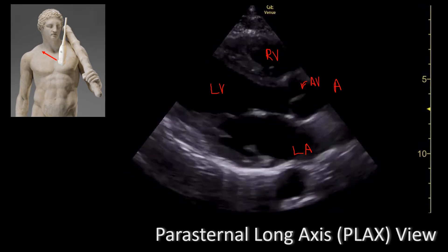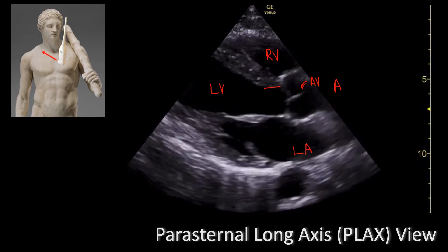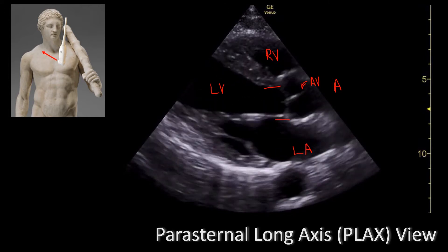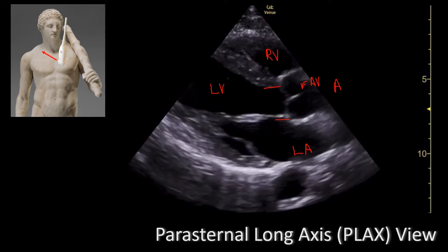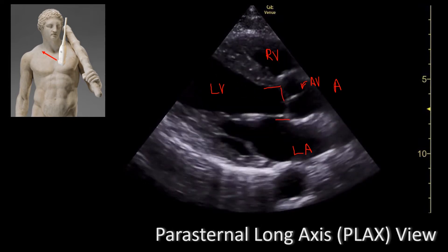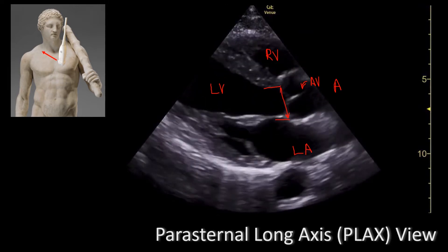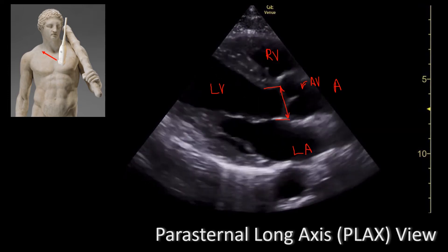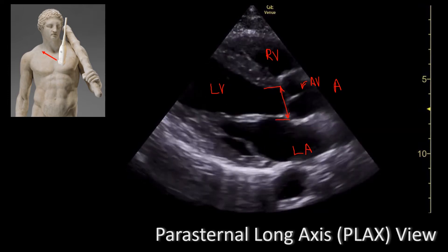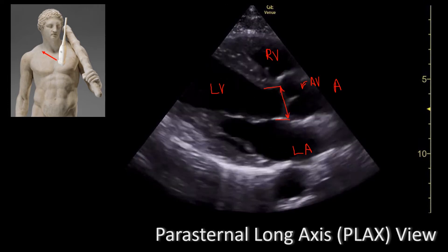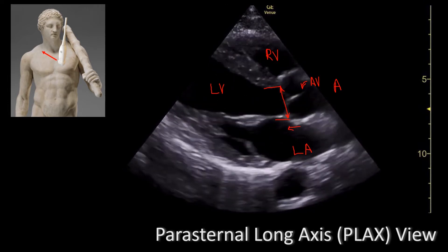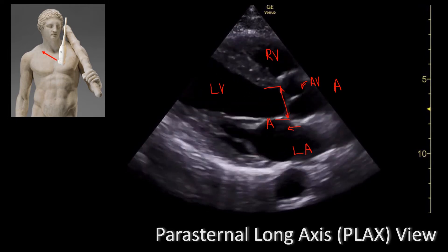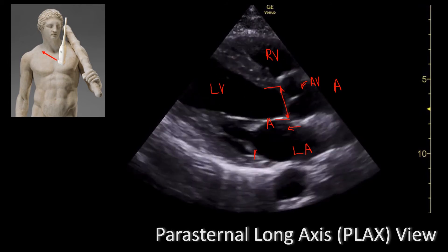Right before the aortic valve, you have a cylindrical structure called the left ventricular outflow tract, or LVOT. What's very important about the LVOT is that it's a cylinder, so you can actually measure the diameter. If we know the diameter, you can calculate the stroke volume and later on you can calculate the cardiac output. The leaflet of the mitral valve that is closer to your probe will be the anterior leaflet and the opposite one is the posterior leaflet.